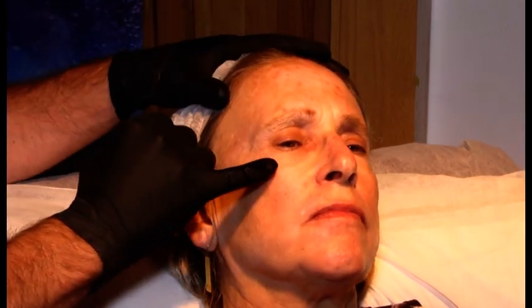All right. Oh yeah, and we said we were going to do a little bit of Revive in her crow's feet area, periorbital. All right, let's start with some anesthesia, some marker. Can I have a marker? Thank you.